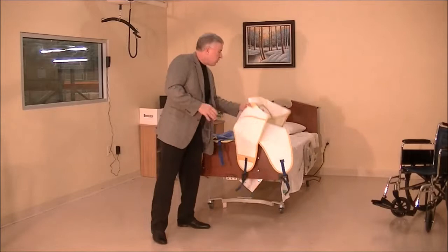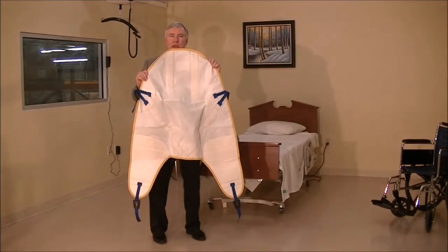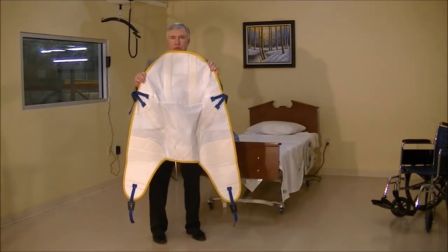We also have introduced the patient-specific version as well, or the type that we can just use and not wash, but dispose of when they become soiled too much. Thank you.